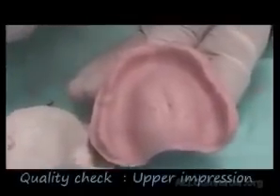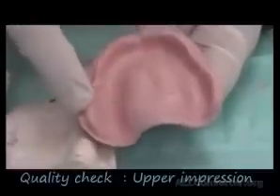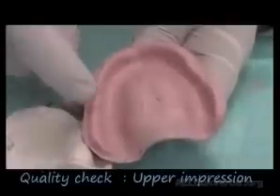Notice that the impression should be checked for quality. What is the quality we check for impressions? We're checking to have a continuous roll of material in the sulci. We check that we have the anatomy clear, so I could see the buccal freni have left notches here. The labial frenum has left a notch here, the buccal freni here. The surface has recorded the rugae area, the tuberosity areas, they are the same as in the patient's mouth. A very small bubble is acceptable. The hamular notches are well recorded and clear on the impression.